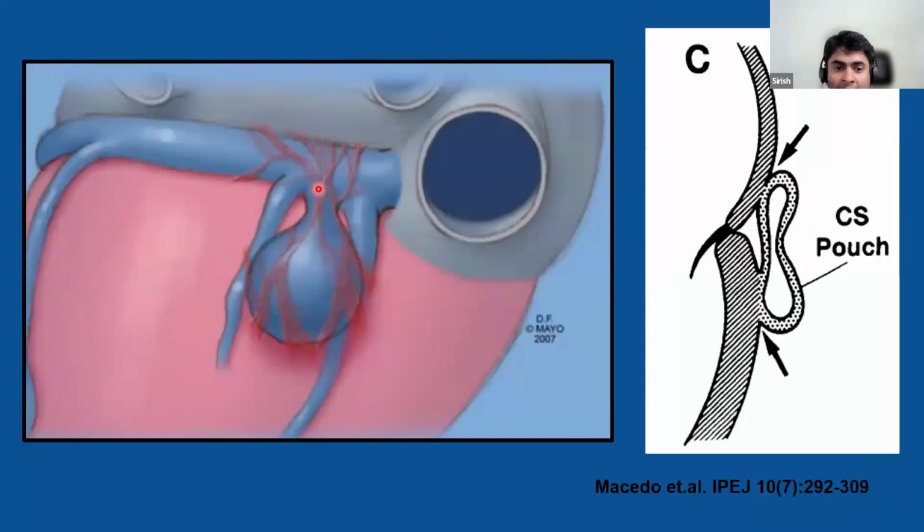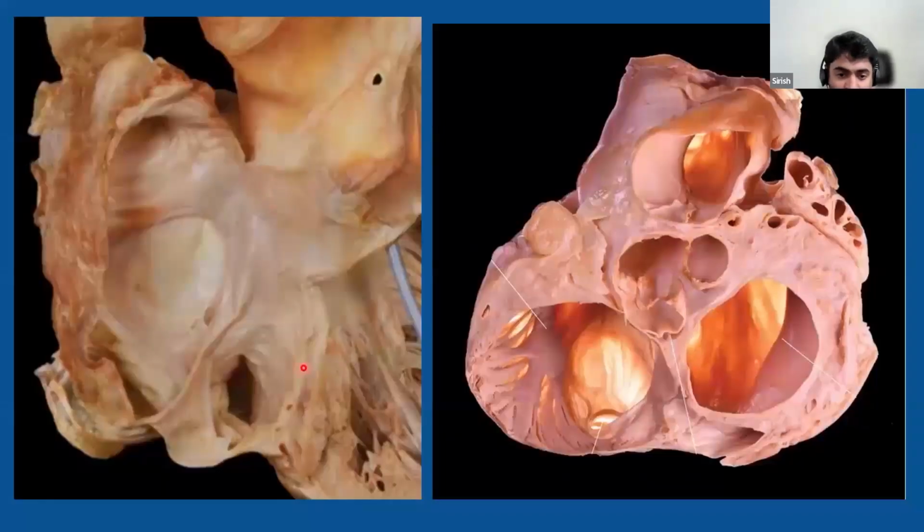So you can see the same thing. Sometimes these coronary sinus pathways are associated with coronary sinus anomalies. These are like spindle-shaped dilatation. Sometimes there are diverticulous or aneurysmal dilatations or pouches here. So the point here is we may have to map into this coronary sinus also when you have a posteroseptal type of pre-excitation.